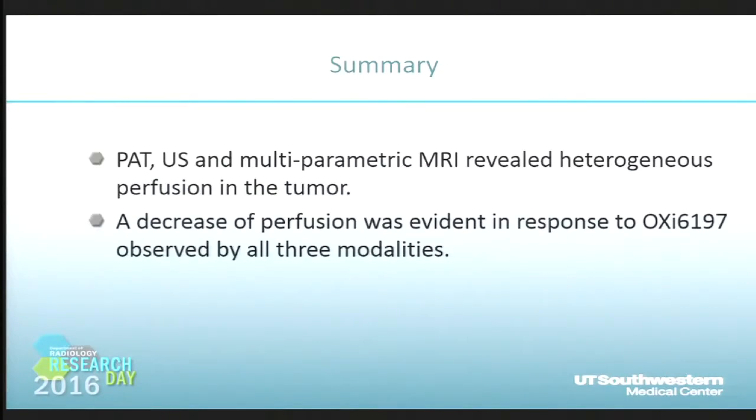So in summary, all three of the modalities show a heterogeneous perfusion pattern in this tumor, and all of them showed an evident decrease of perfusion after the vascular disrupting agent. We found photoacoustic tomography to be a really sensitive modality for oxygen challenge and also for the change of perfusion, so it's very suitable for vascular disrupting agent studies. We're really excited about this new instrument. There are so many possibilities, and we welcome any collaboration, any suggestions.